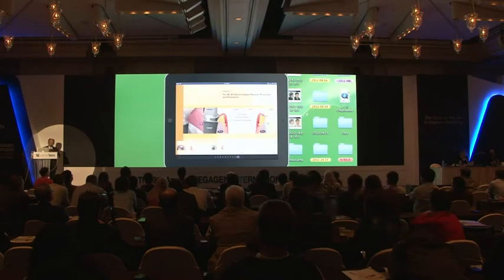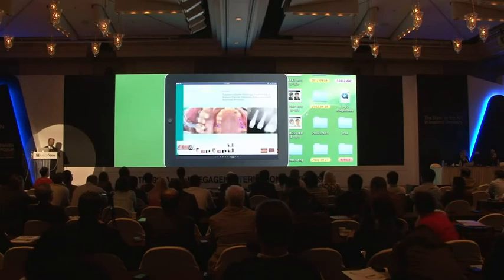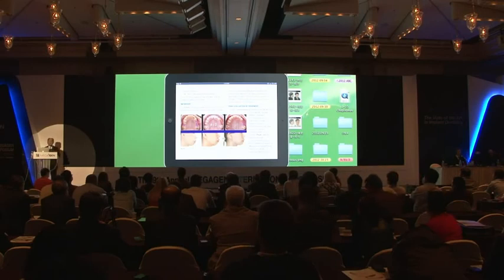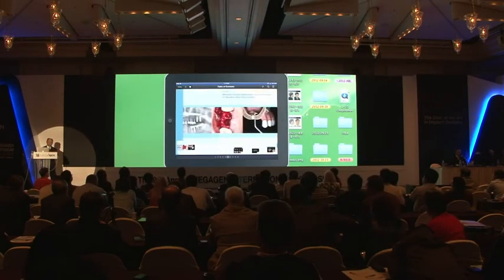So with that, if we run through it, we will show you different kinds of ortho and implant combined cases like this. For this case, for example, if you have a case like this, and if you don't do the ortho, you will end up with maybe 4 implants. But with orthodontic treatment, you'll be able to reduce to 2 implants. But most important, you can change the profile from bimaxillary protrusion to a very pleasing profile. That tells you why ortho and implant combined is the way to go.